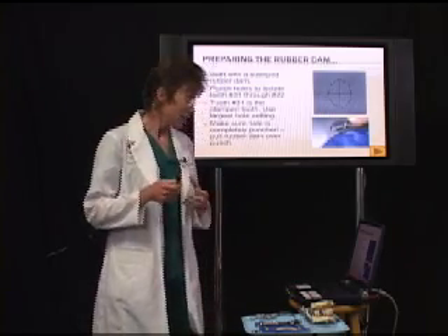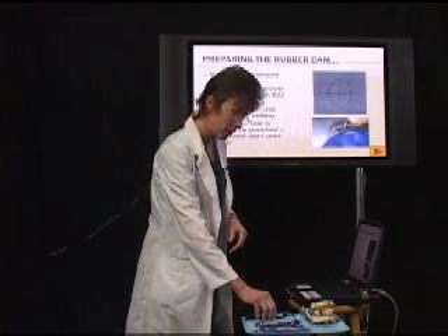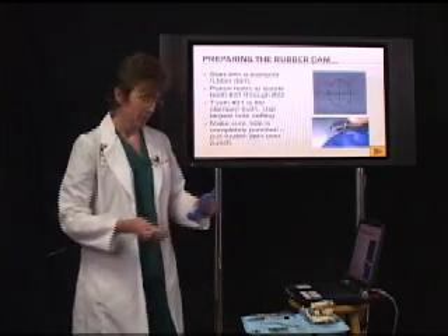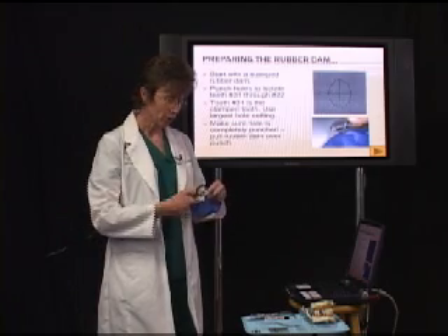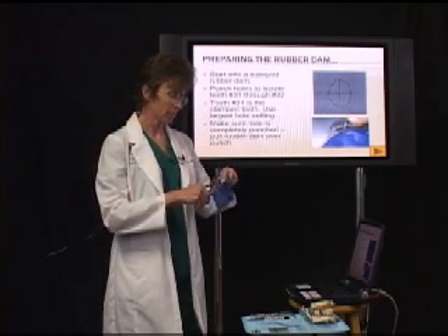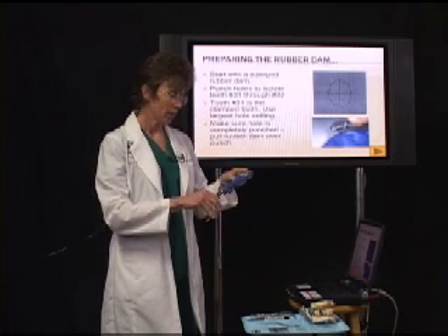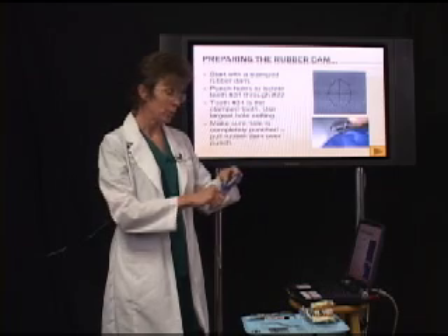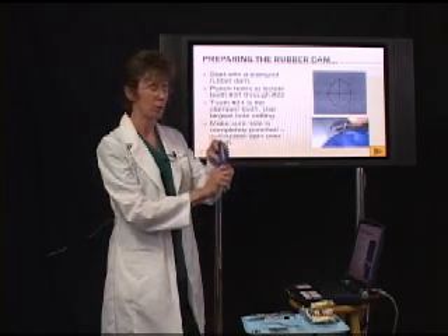When we punch the dam, we're going to use our rubber dam punch and punch the dam for those teeth. When you punch the dam, make sure that you punch the hole all the way through, and pull the dam through the punch to ensure that you've got it all the way through with no tags.